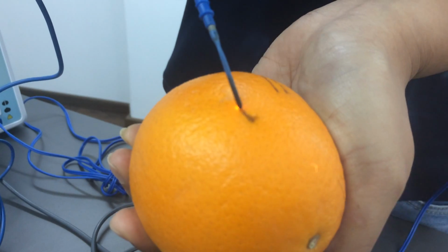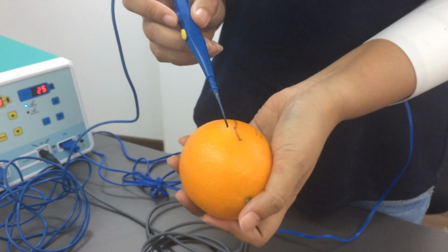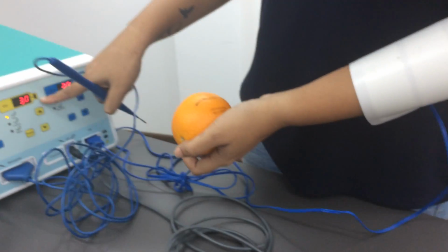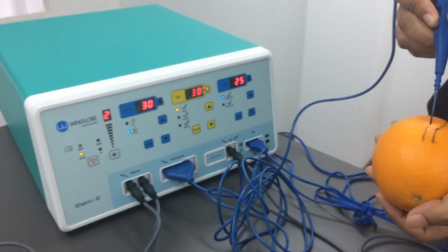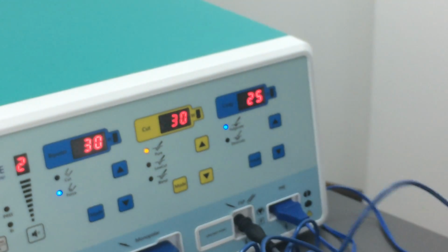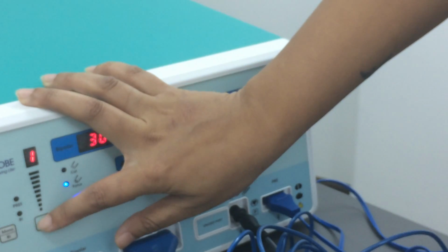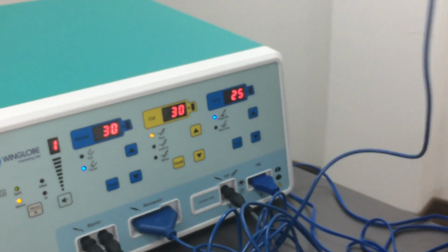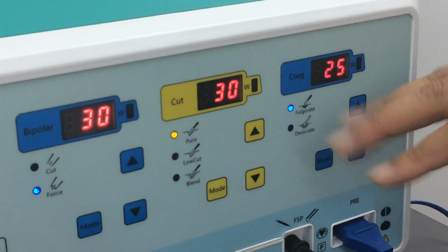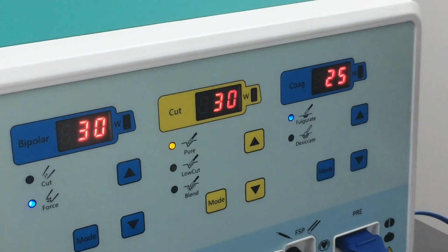If you can see, I am using the cut mode at 30 watt and it is cutting perfectly smoothly. As you can see, whenever it's being activated, there is a lightning symbol that comes on the screen. So in case your volume is set very low and you're unable to hear which mode is being activated, and you want to know which mode is being used by the surgeon, you can just look at the screen and see the lightning being on.